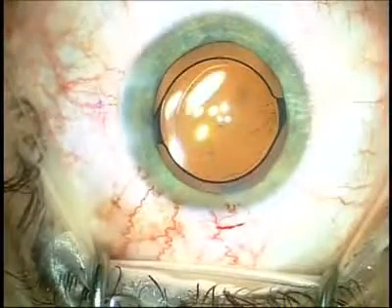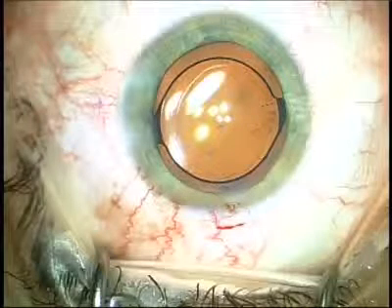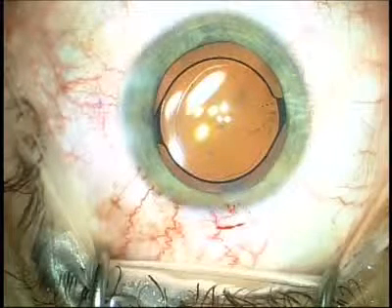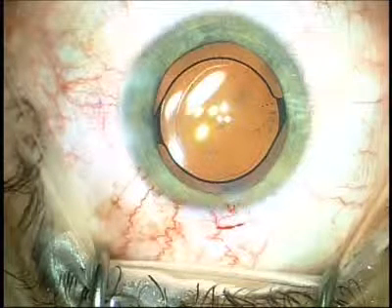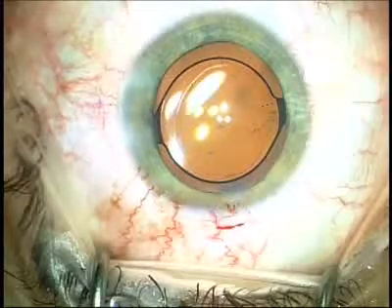You can also see how much detail there is present in the edge of the IOL, the edge of the capsulotomy, and the overall clarity. One of the things that's quite remarkable when you use the Helon and Helon 5 technique is how optically clear the anterior chamber is immediately after the surgery and the first day post-op.